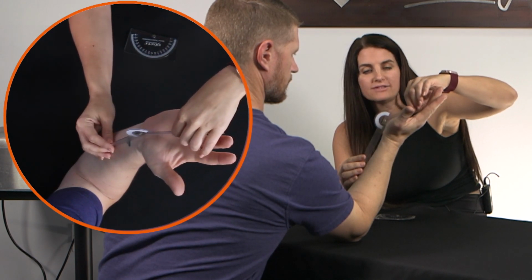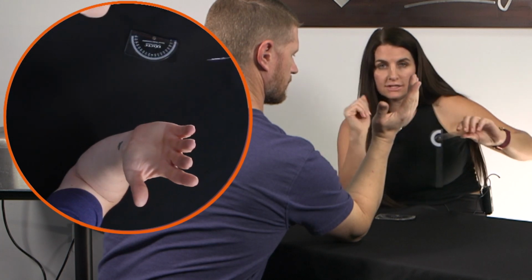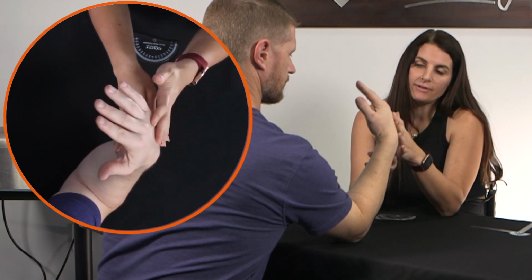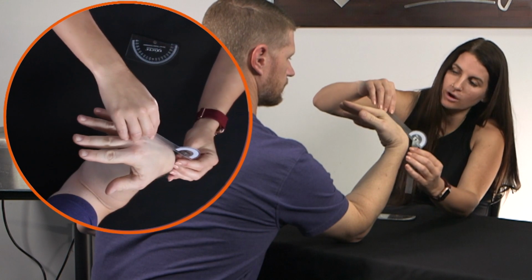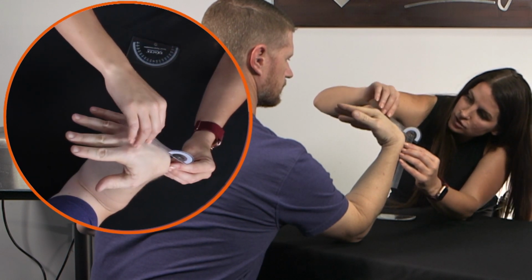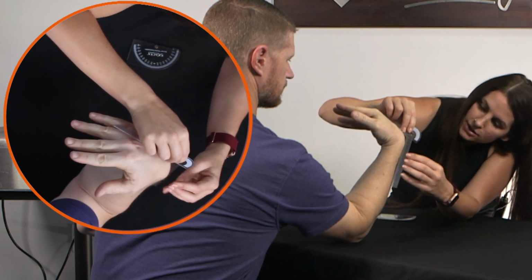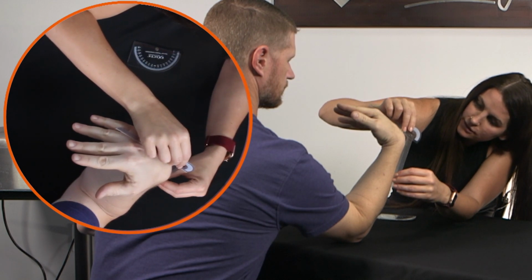And if, say, they had a big cyst or something, you could go off to the side, but you would need to document that it's different and why you did it differently, because it's not the standardized way. Now wrist flexion. Wrist flexion, same thing. It goes between the long and ring finger. And you want it directly over the wrist, and this part straight up and down, and you want it parallel with the wrist.